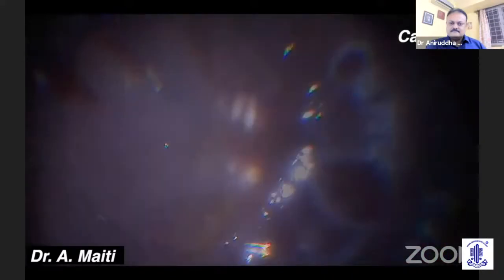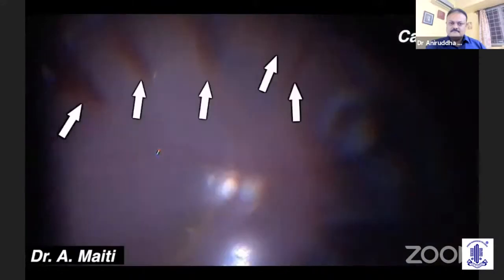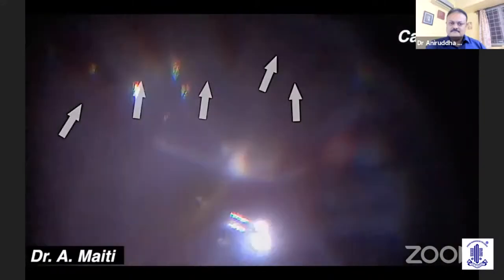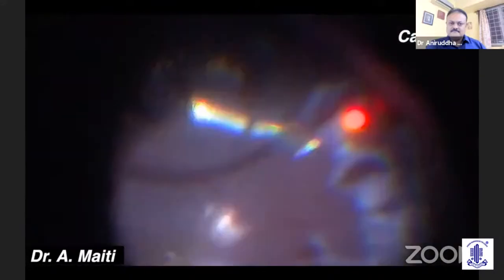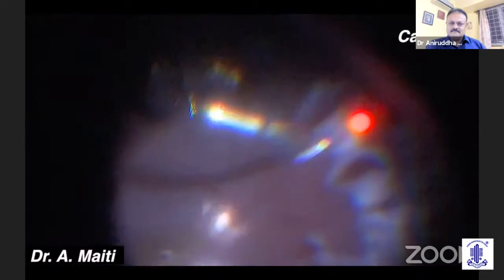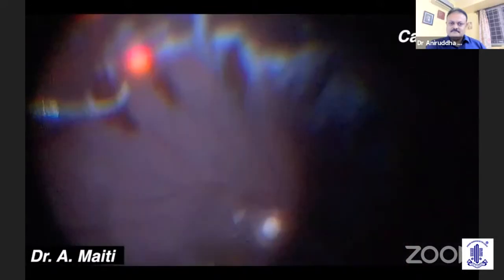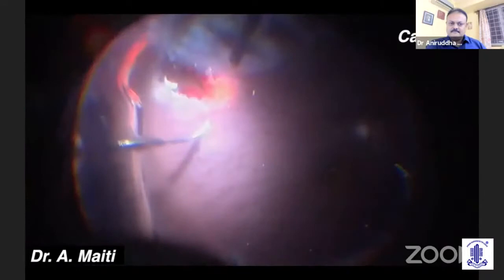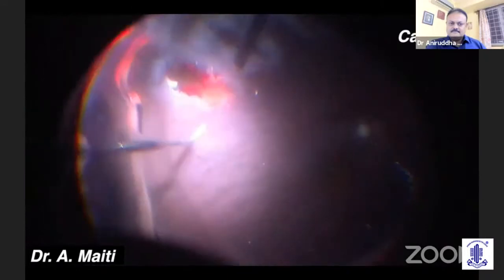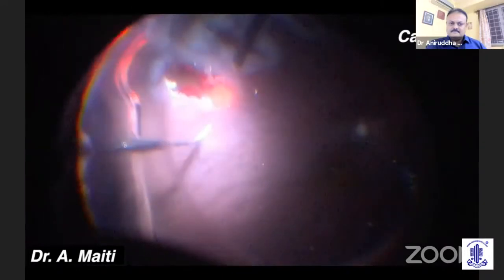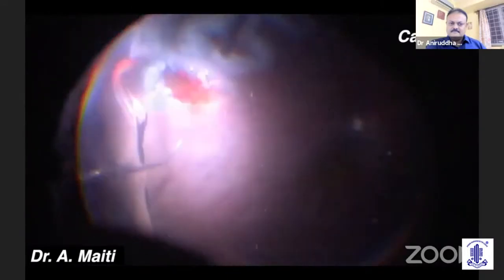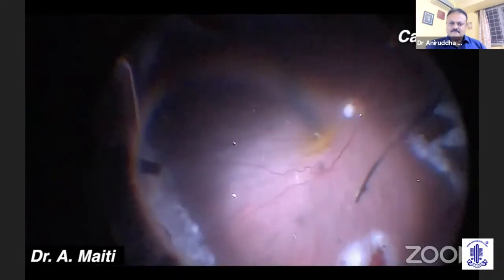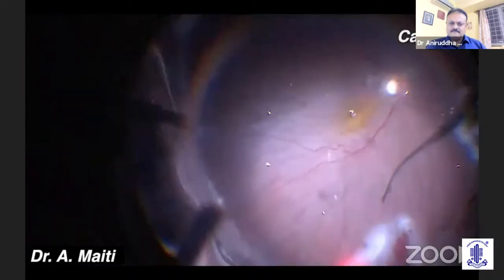The cause of the multiple retinectomies might be a stiff and atrophic retina. Putting a 360-degree encircling band might have prevented the multiple radial retinectomies. At the end, we had a nicely settled retina, and silicone oil was injected as tamponade.